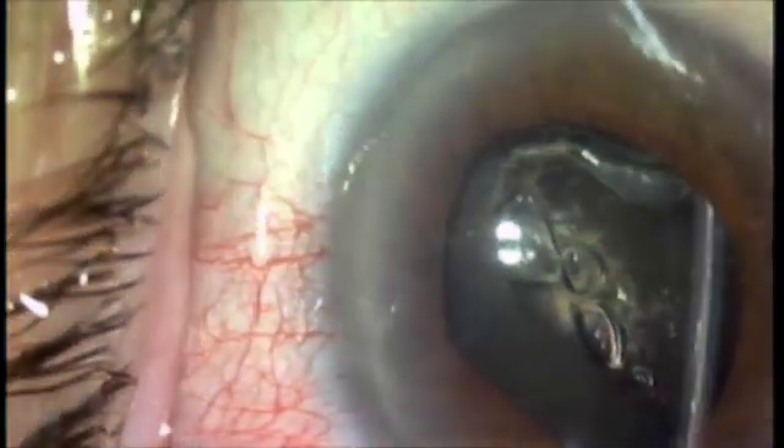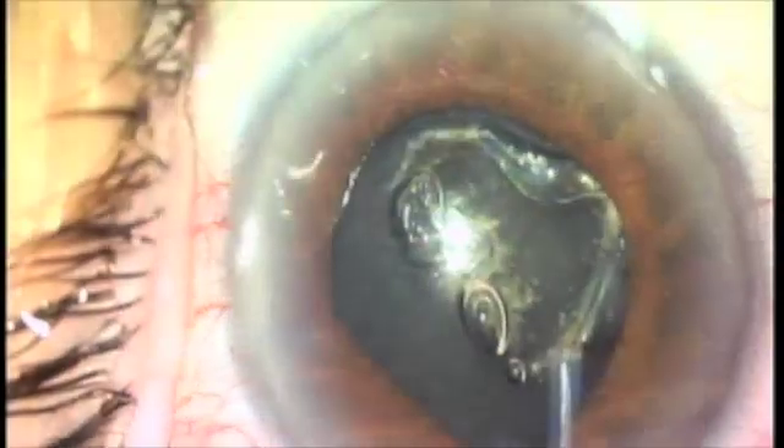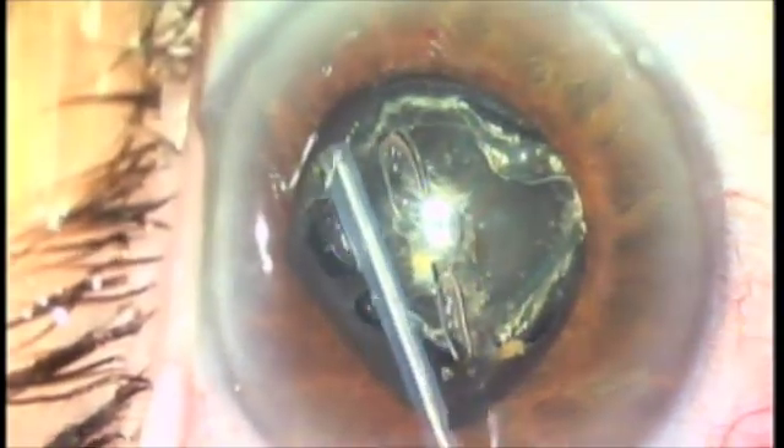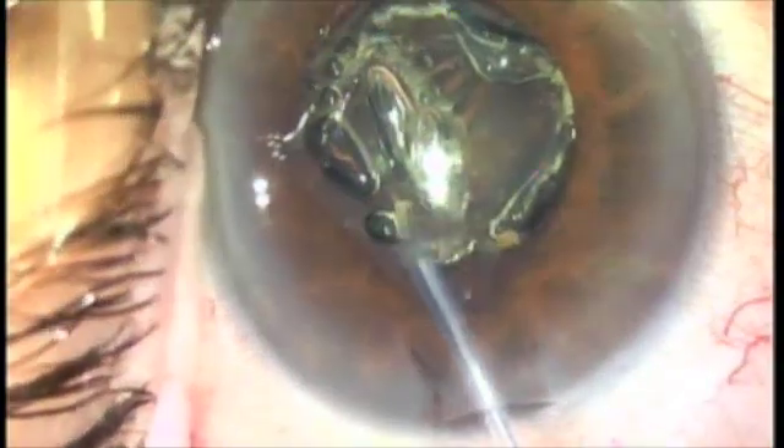Take a look at the tips — you can actually see, look at it closely, right there: the ablation as we're ablating the anterior capsule.